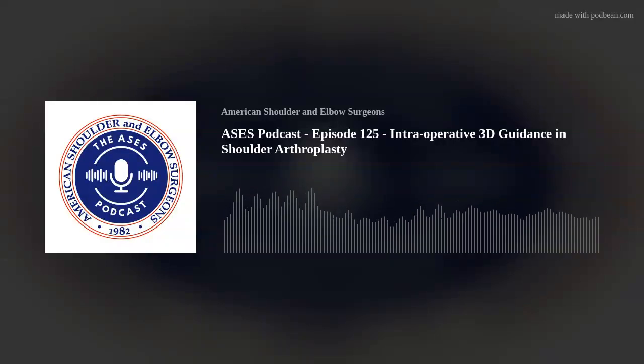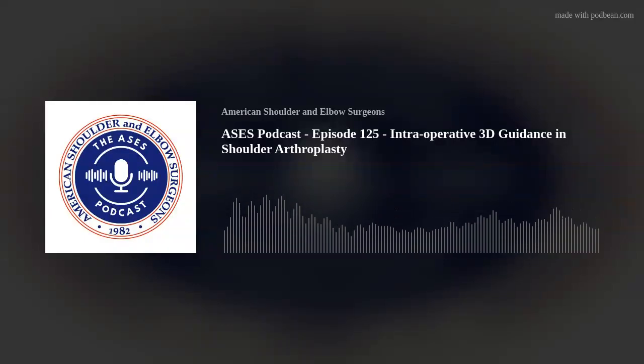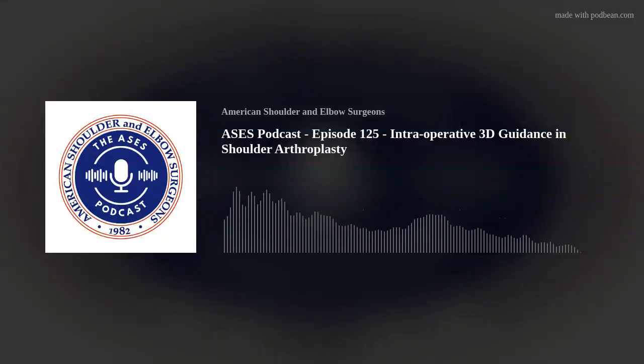So, the nice part about using a navigation or a robotic system is you can actually validate the position of your implant when you leave the OR, so you know exactly where that implant was left. And I think that's the data that's going to be critical as we move forward with looking at big data and trying to analyze where the optimal implant position is going to be, for individual patients, but also, in general.